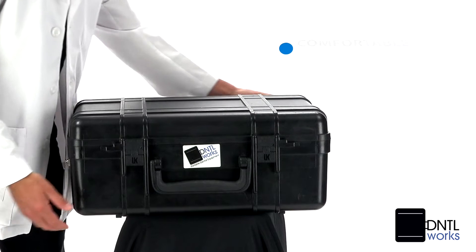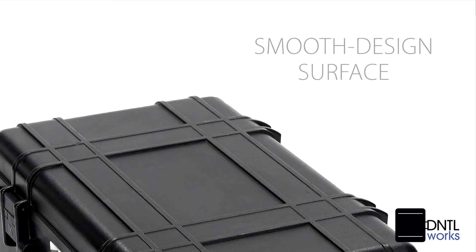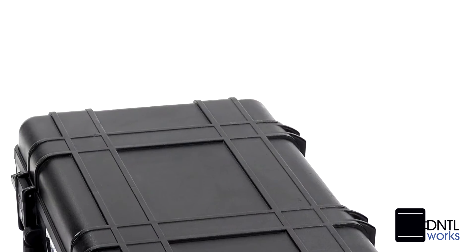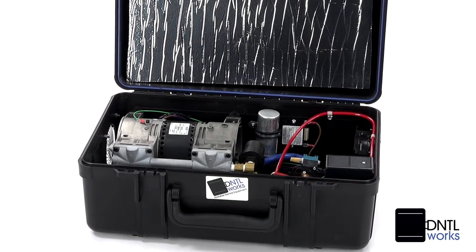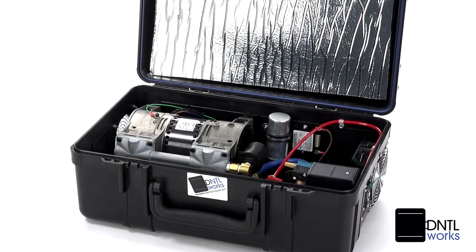It has comfortable carrying handles and the smooth design of its surface allows for easy maintenance. The unit's clean air supply is moisture and oil-free, and the efficient one-third horsepower motor is perfect for quiet operation.